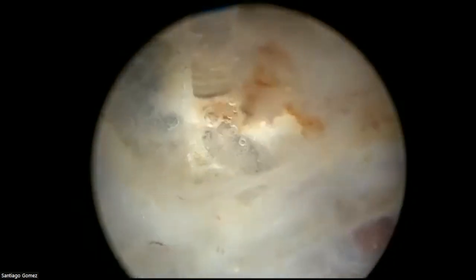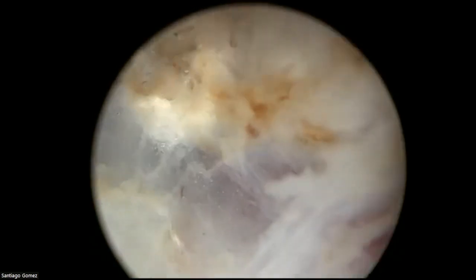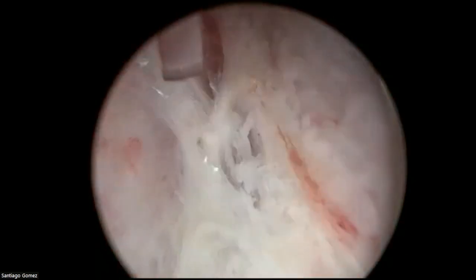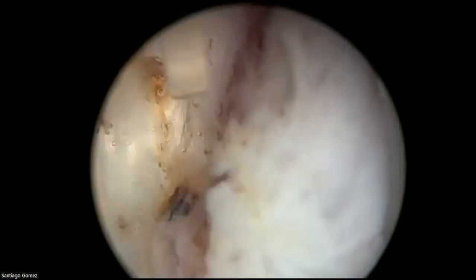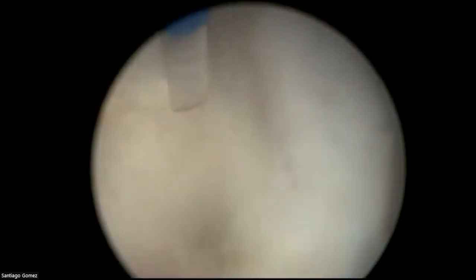So very carefully, we have advanced more rapidly in the rest of the circumference. But here I'm trying to go a little bit slower and very careful, not to deepen my dissection too much. So there we are, slowly getting better. You see, I always protect the line because the line is your savior. If you carry a nice line that you can follow, I think it's safer. It's much safer and you have a reference, and I trust my lines a lot.